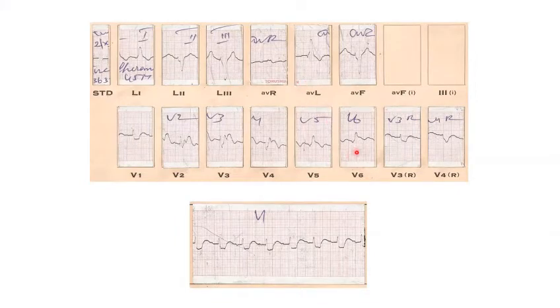Normally in left bundle branch block, we don't expect Q waves in V5 and V6, and a prominent R wave in V1 is also not there. So if these things are there, those are all points which may make us suspect that the patient may be having associated myocardial infarction. So you look up how to diagnose myocardial infarction in presence of a left bundle branch block. We will discuss it in one of the sessions. Any other doubts? No, sir. So this is a 2:1 block.